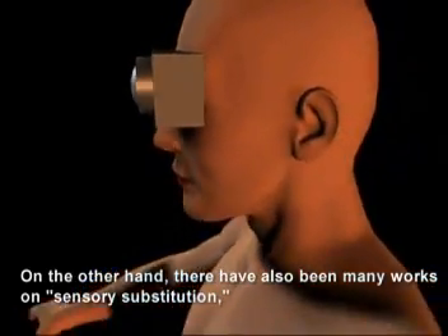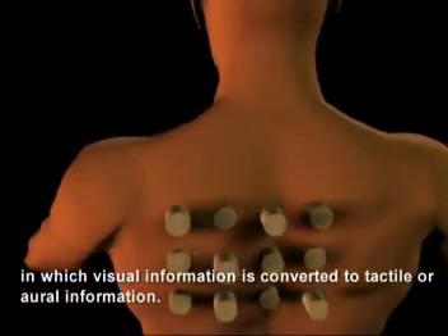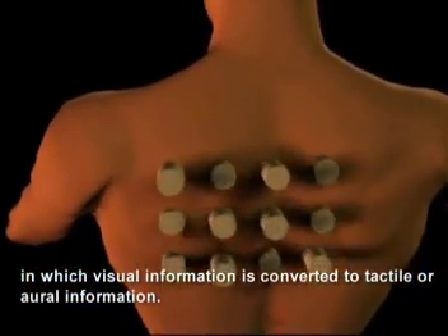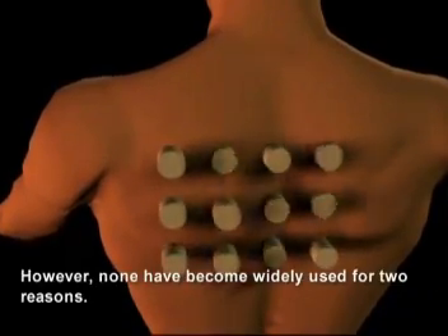On the other hand, there have also been many works on sensory substitution, in which visual information is converted to tactile or aural information. However, none have become widely used, for two reasons.